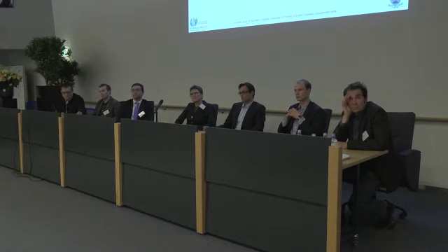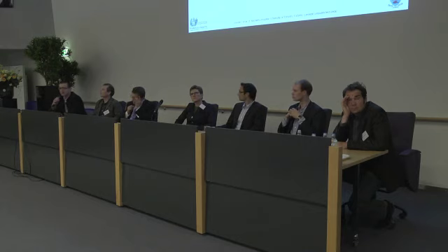Doctor? Hi. I have a question regarding the Nava level titration, and this deals with the optimal pressure level. How high of a pressure are you willing to accept in order to reach a point where the EDI begins to decrease as you increase the Nava level, offloading? Because it seems to be a question I'm asked often in clinical settings. Sometimes 30 is not enough, but if you go up to a pressure of 40, then all of a sudden you have the EDI beginning to go down, and then you're out of that zone. Any advice on that? Lucas.